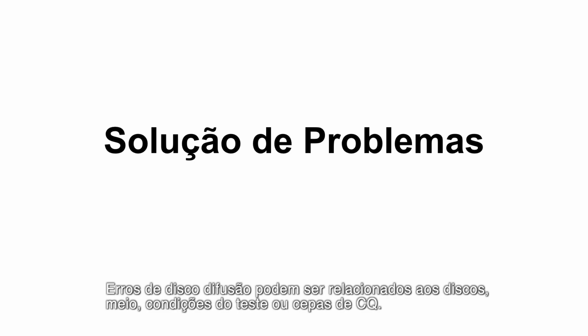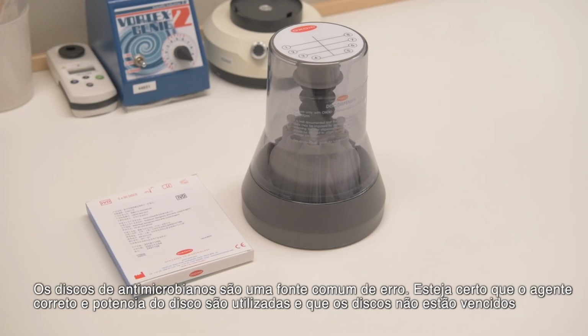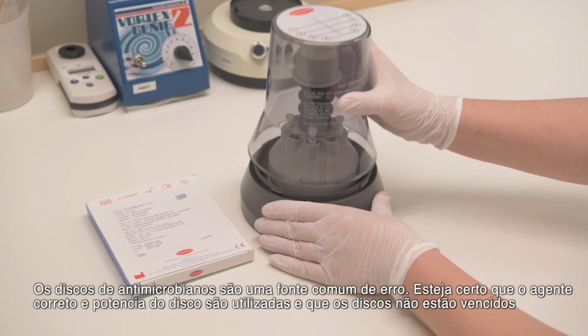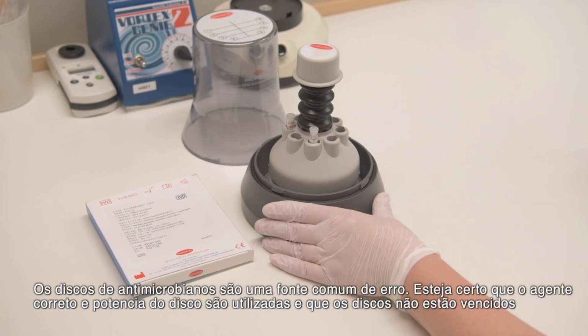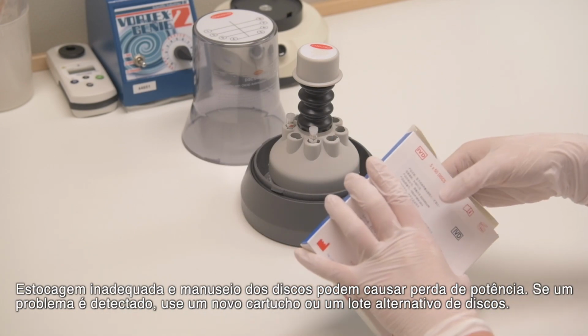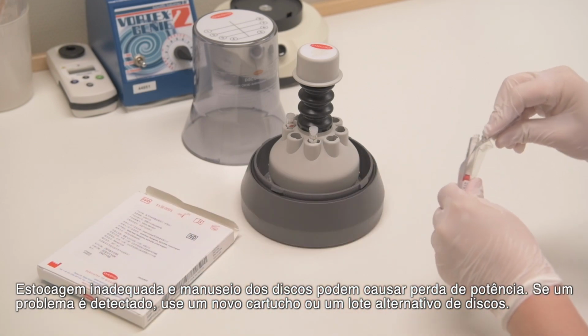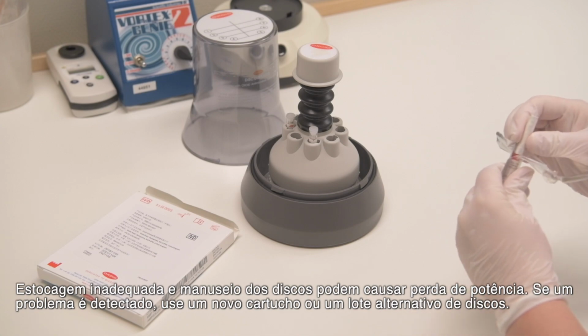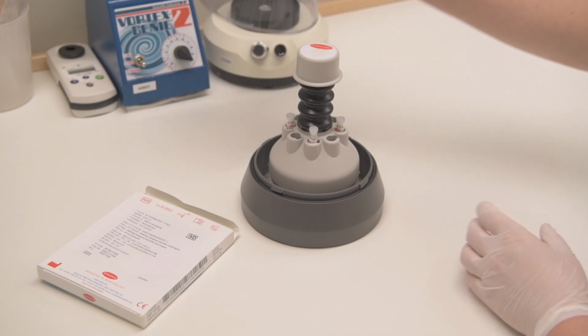Errors in disc diffusion may be related to discs, media, test conditions, or QC strains. A common source of error is the antimicrobial disc. Make sure that correct agent and disc potency is used and that discs have not expired. Incorrect storage and handling of discs can cause loss of potency. If a problem is detected, use a new cartridge or an alternative lot of discs.